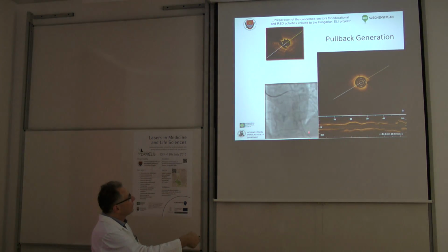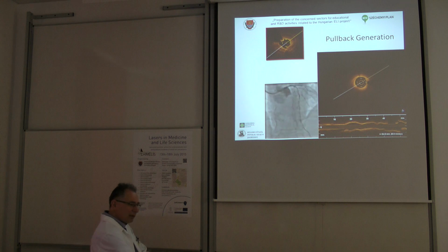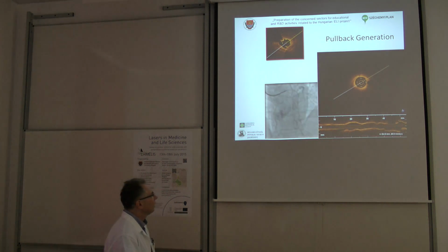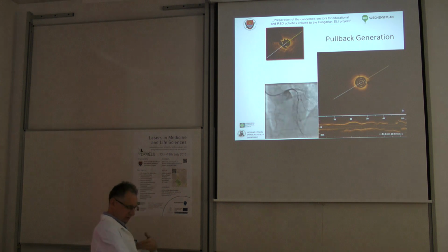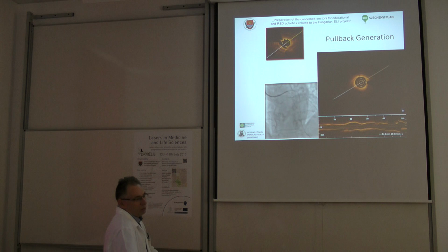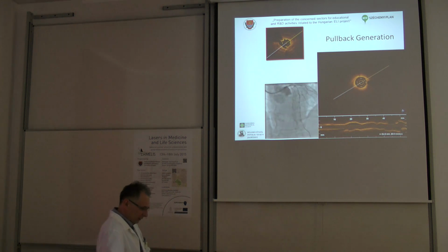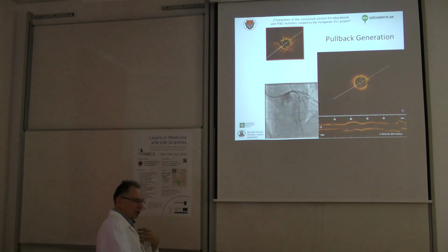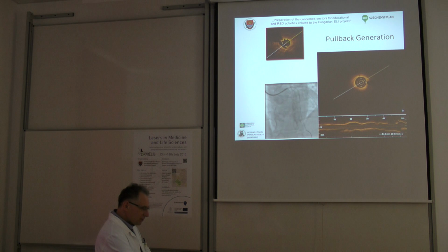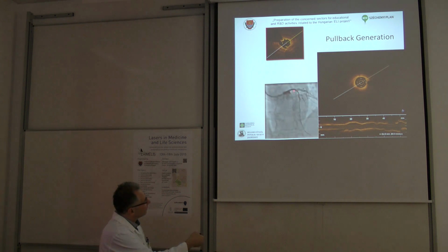The guide wire, the proximal part, goes up. We introduce it from the outside. Generally, these wires are about 180 centimeters long. Because 100 centimeters is the guiding catheter, which goes like this. If it's a small patient, it needs only 70 centimeters, but if it's a large one, almost 100 centimeters, from the outside to reach the very proximal part of the coronary arteries. From the outside, we introduce this wire inside the guiding catheter, and it needs another 20, sometimes 25 centimeters inside the coronary artery.